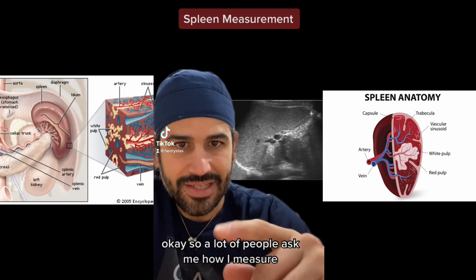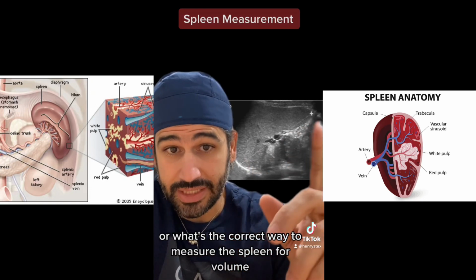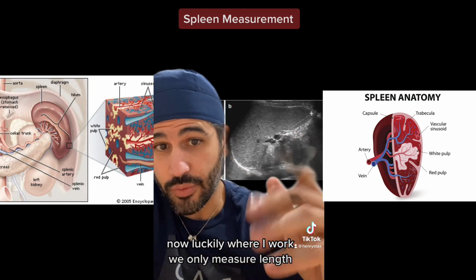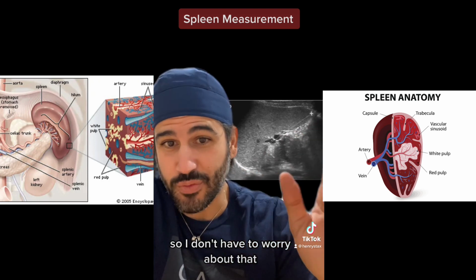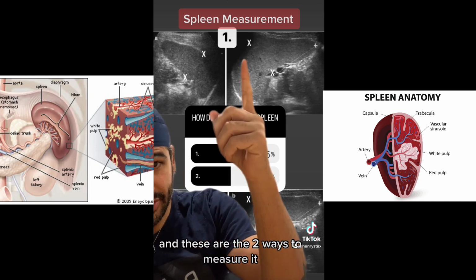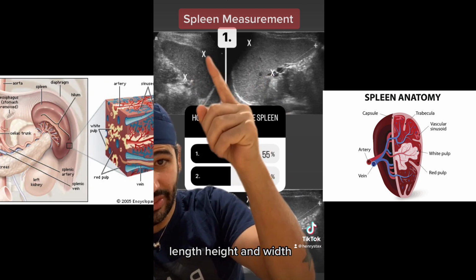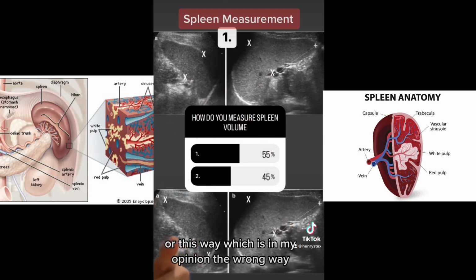Okay, so a lot of people ask me how I measure, or what's the correct way to measure the spleen for volume. Now, luckily, where I work, we only measure length, so I don't have to worry about that. I've put it to a poll, and these are the two ways to measure it: length, height, and width, or this way, which is, in my opinion, the wrong way.